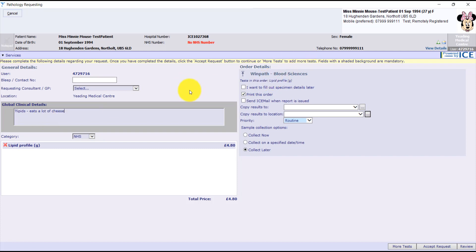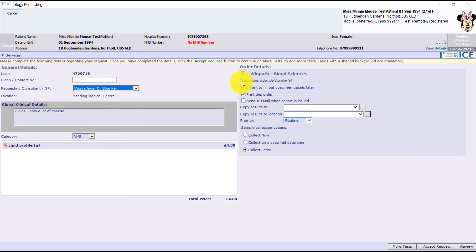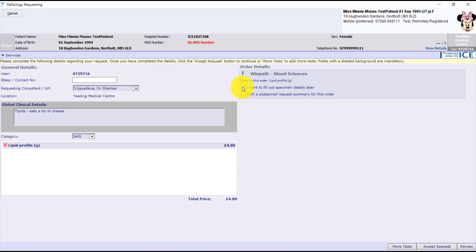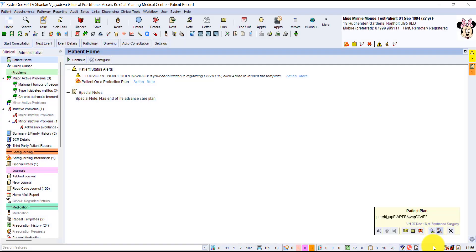So we've made the request. We need to just put in the name. And then on the right hand side, this is really important. So we click on I want to fill out specimen details later. The reason we're doing this is that she's not coming for the blood test right now. She's going to come and book it in a week or so. So we click that we want to do it later, and then we accept the request. And that is done.